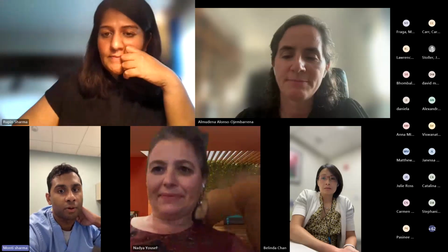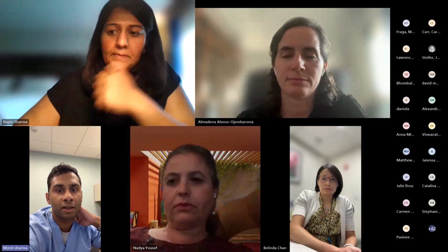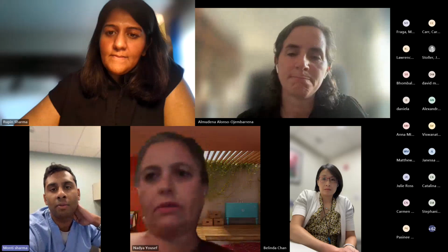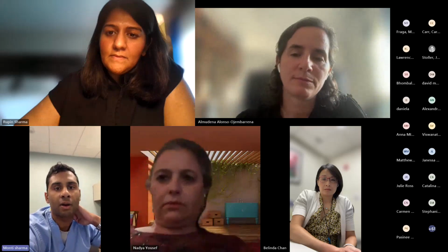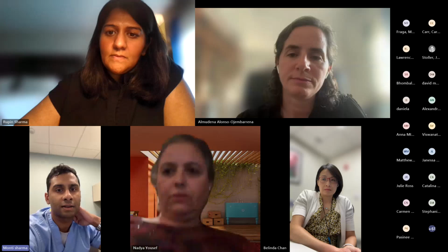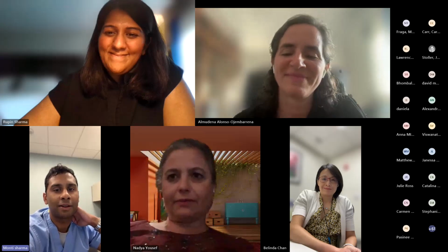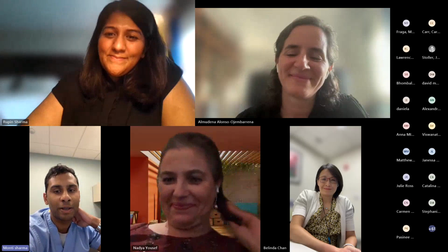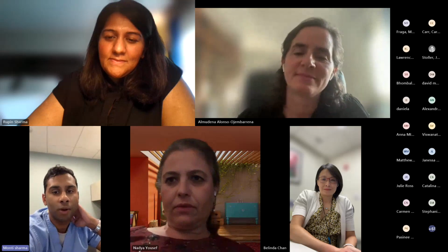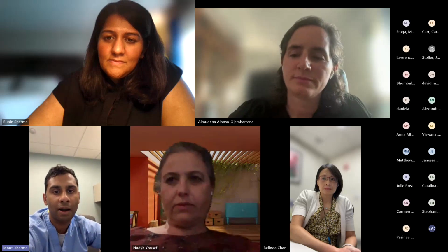I think Nadia brings up a really important thing in my mind, because this is where tracking your internal outcomes is so important, because then you are taking into account that global picture. Like, hey, we all scored that a 9 and we gave that kid surfactant and outcome X happened. Or, hey, we were debating on this and outcome Y happened, right? So then you can learn from it institutionally. Initially, we used to joke that we'll just tell the learner they're wrong, but we found that it tends to be more contentious. As more and more people learn it, there's more and more disagreements. And so I think just having some way to follow what you're doing is really important, whether it's in a QI methodology or maybe even just through QA, just have some outcomes in mind.